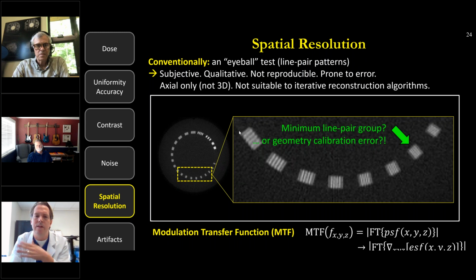For example, cone beam CT systems need very accurate geometric calibration. And sometimes when the geometric calibration starts to fail, your C-arm is banged around in the hallway and so forth, and that can actually come through in interesting ways. One way is that it can give you false information in a line pair test, where in fact, you see how this actually looks like a pretty good representation of a line pair pattern.